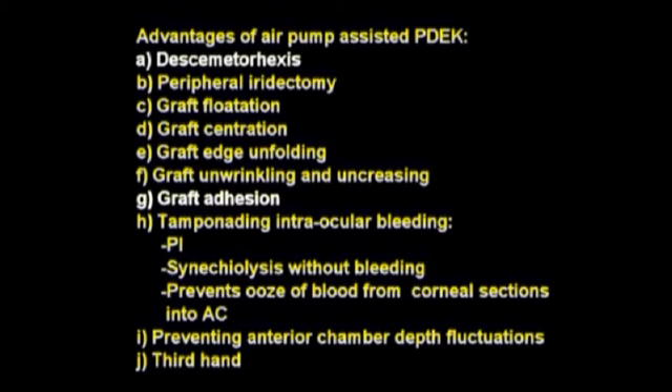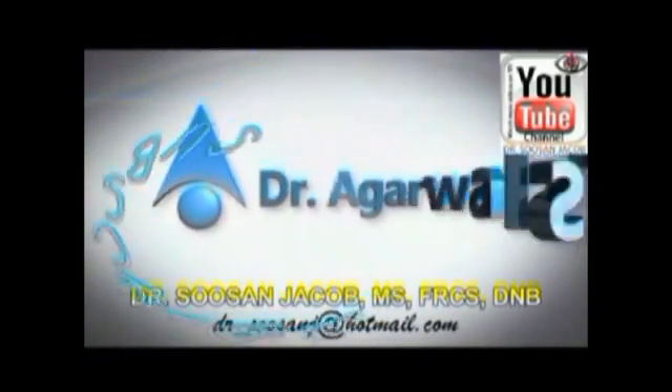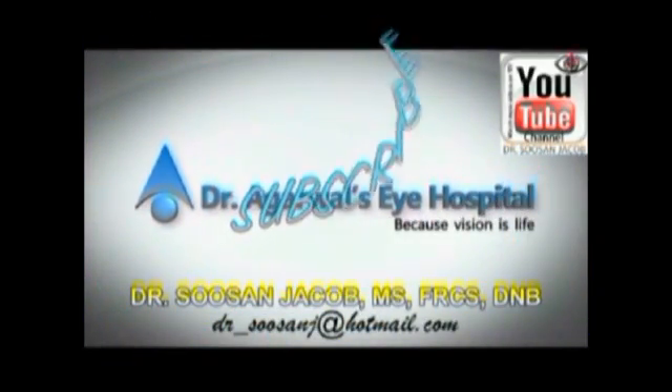Using pressurized air infused through the anterior chamber maintainer via an air pump has great advantages especially in PDEC surgery, where it can be used to effectively center the graft, unfold extreme peripheral edge folds, uncrease the graft, and act as a third hand during all steps to prevent graft dislocation and anterior chamber fluctuations. I do hope you enjoyed watching this video — thank you so much.